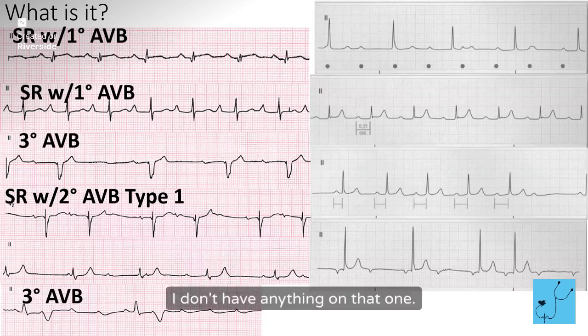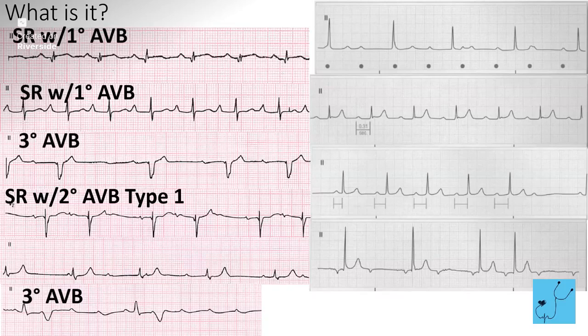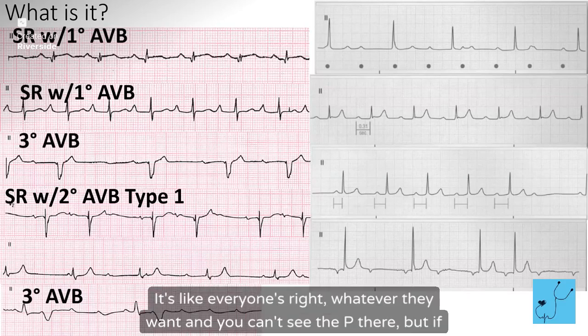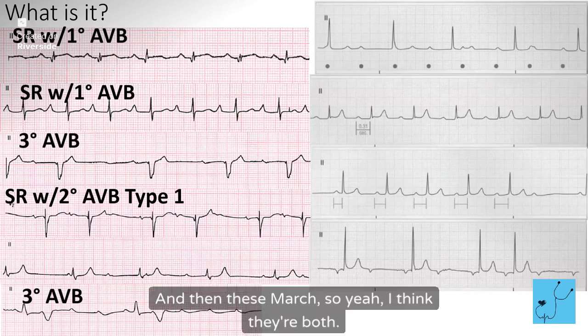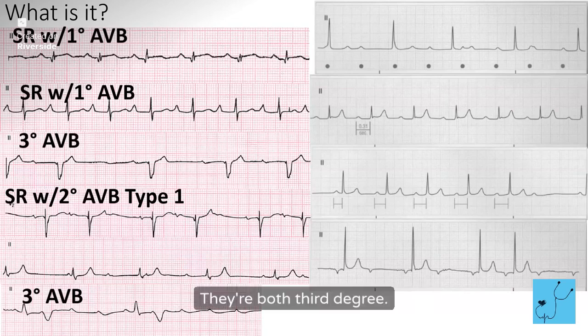Oh, I don't have anything on that one. I was like, wait, because everyone's doing whatever they want, and you can't see the P there, but if there was one, right? And then these march. So yeah, I think they're both 3rd degree.